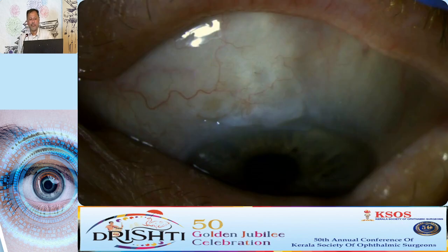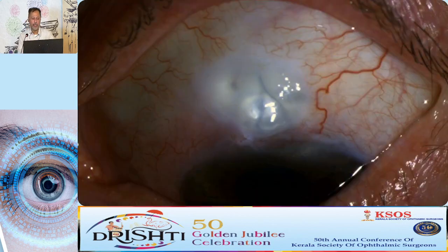This is the fellow eye of the same patient. This needs to go for cataract surgery, and you can see this is the sort of cataracts that we do back in the UK. Unlike the ones that you guys were doing trabs on, they would have had their cataracts a long time earlier. And this is a lovely bleb, and you have to have a strategy to operate on someone like this. Here again, I'd probably use a mitomycin in the area where there's no bleb, but I'll definitely give some intraoperative mitomycin and just make sure that you have a clean surgery.